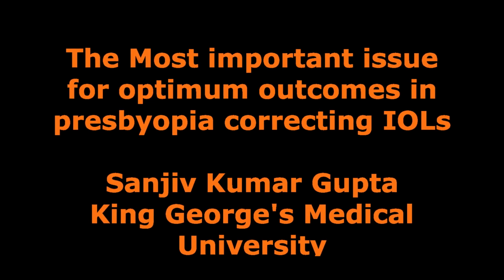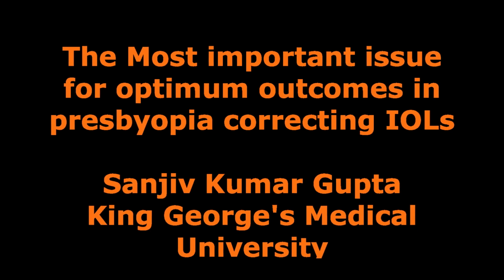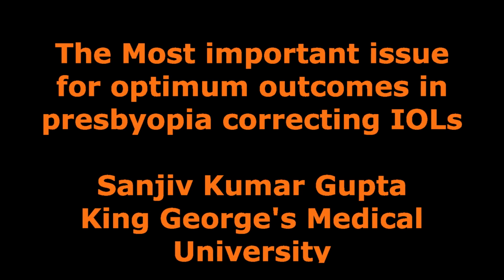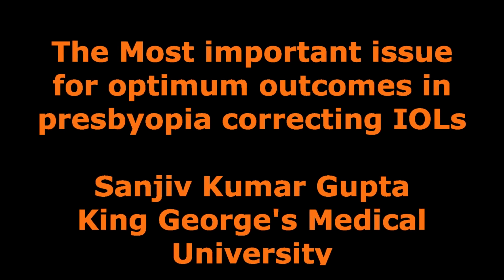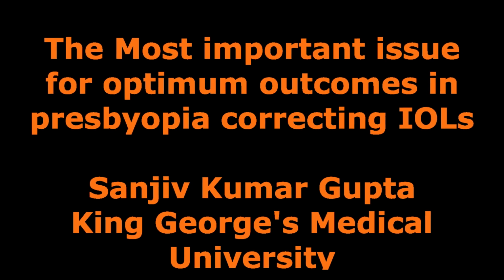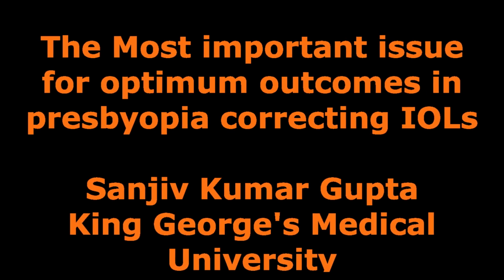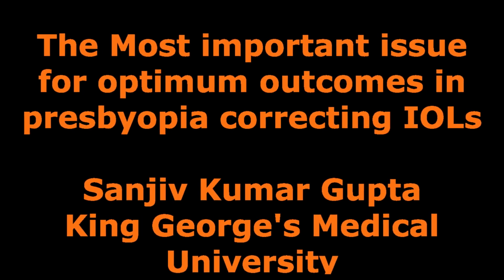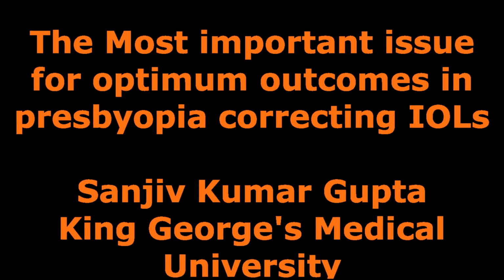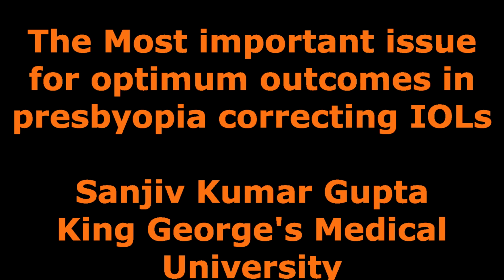Cataract surgery presently in its state is more of a refractive surgery, and there are situations where the patients want to get rid of their glasses, especially the near corrections, and there are IOLs which can provide this facility. And so there are some issues which are to be handled when implanting such a lens.